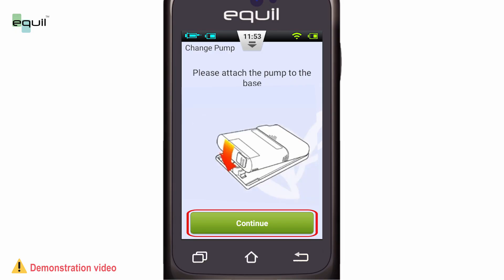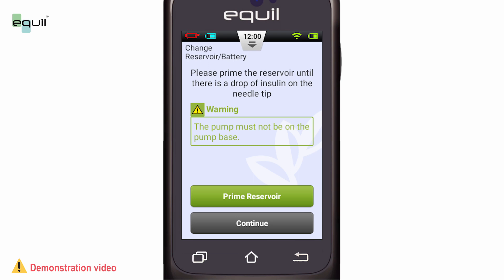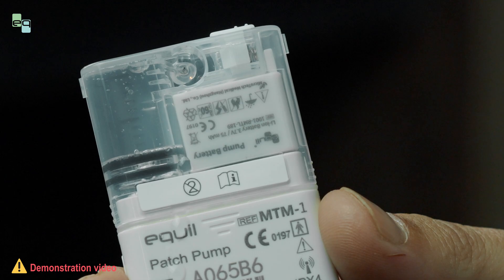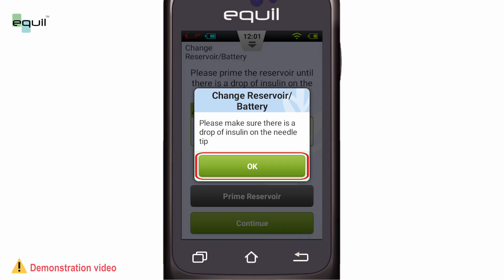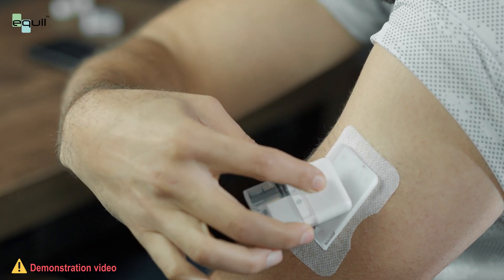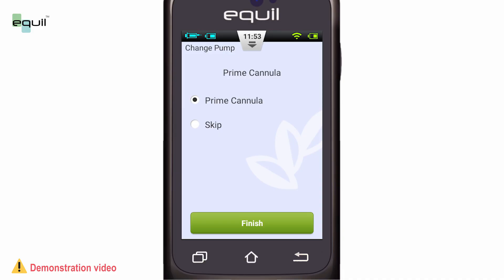Assemble pump and reservoir. Select Continue. Hold the pump as such. Select Prime Reservoir. And wait until we see an insulin drop. Select Yes in the confirmation message. Select Continue. Attach pump to its base, following the same previous instructions. Choose whether to prime the canula or not according to the condition explained earlier. Select Finish.